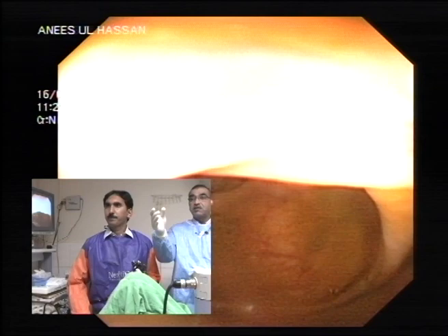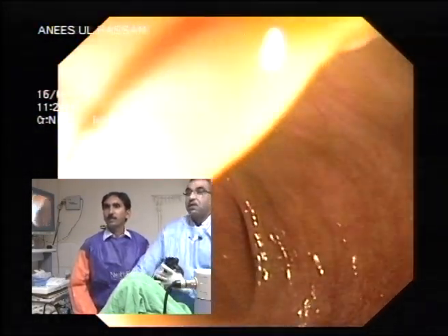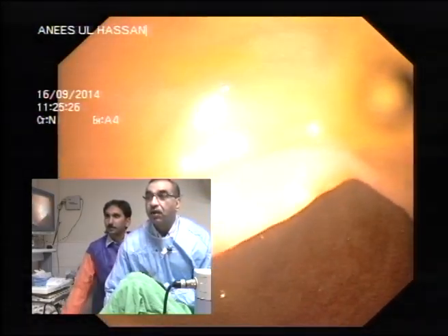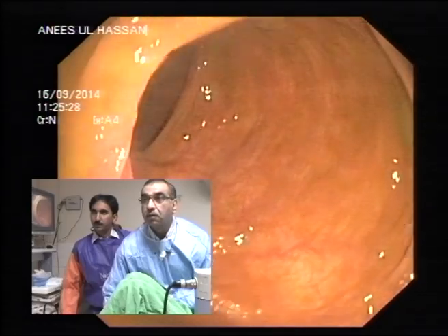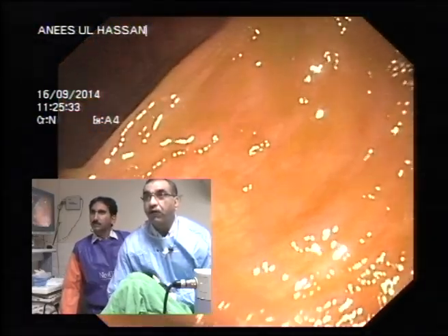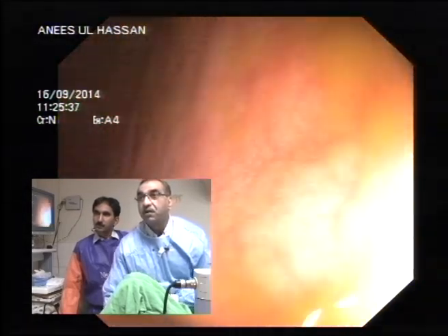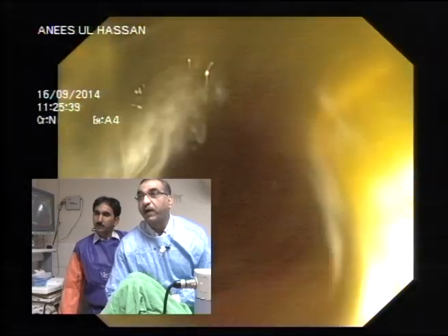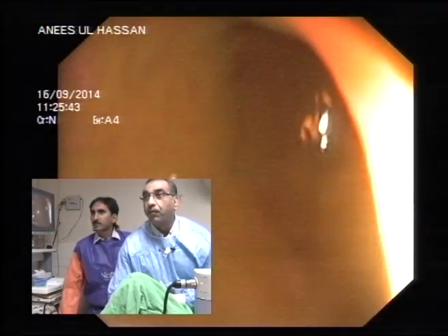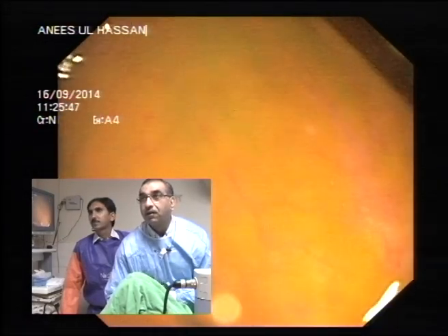Yeah. Okay. Now, just a minute. When this happens, you have to go back in again, right? So you see, in one flick of an eye, you have lost so much ground. See all that ground without inspecting, right? So that was a bad withdrawal technique, right?